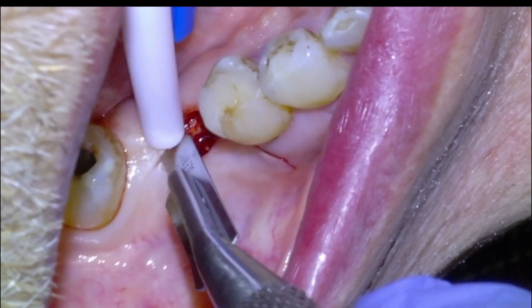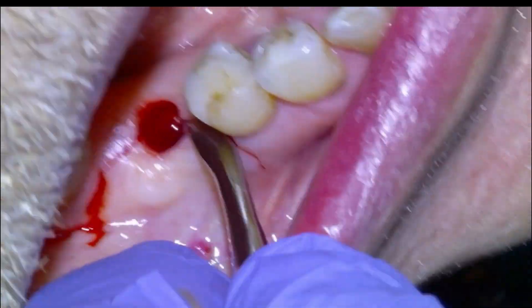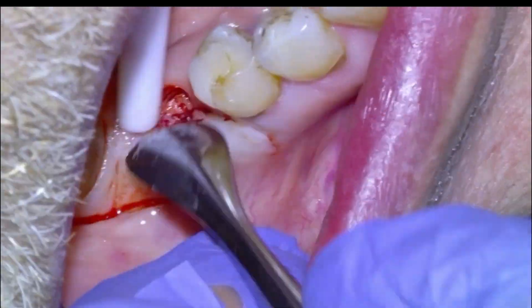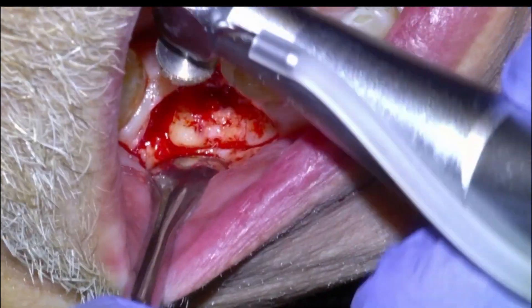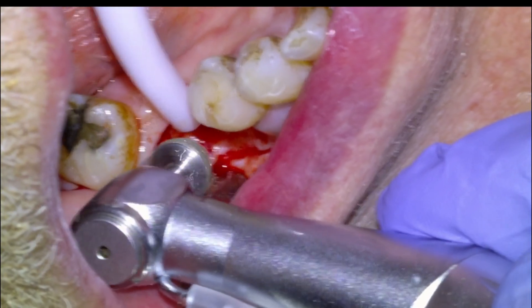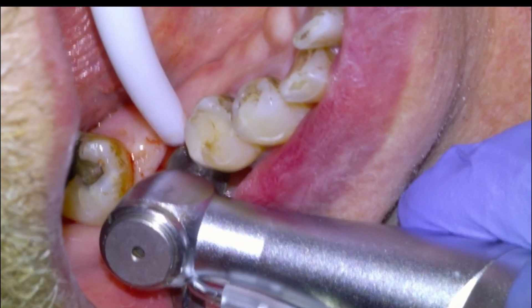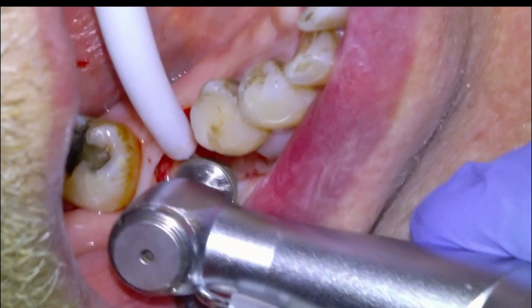Fast forwarding a little here. You can see there's plenty of bone horizontally and vertically from the x-ray, so it's going to be fairly straightforward. There's a little buccal exostosis that I'm just going to take off with the tissue profiler to make a nice uniform site for healing. Then we'll get started with the osteotomy.